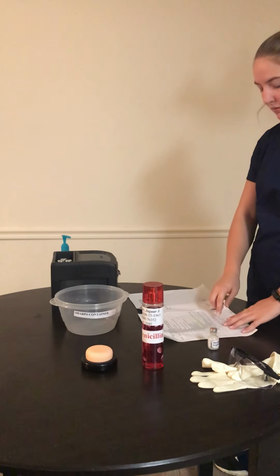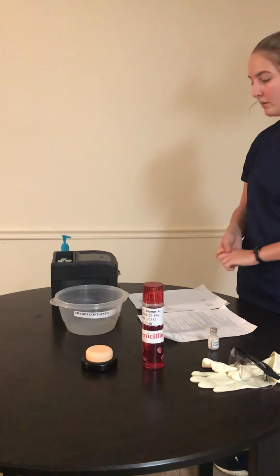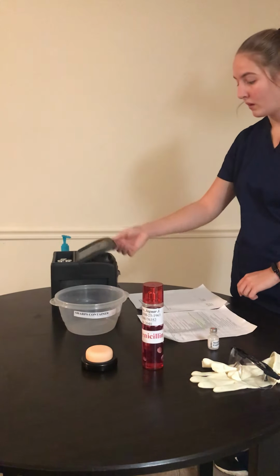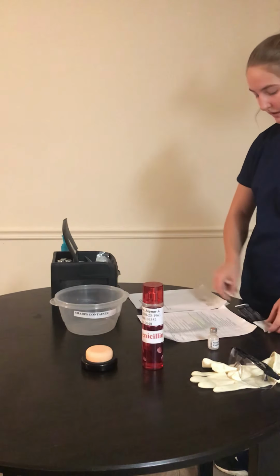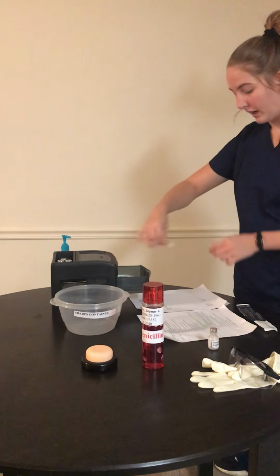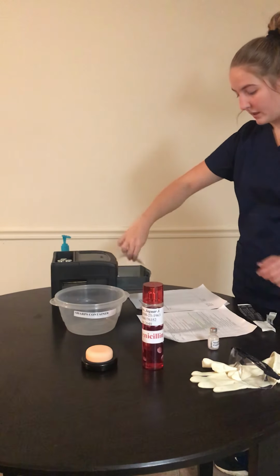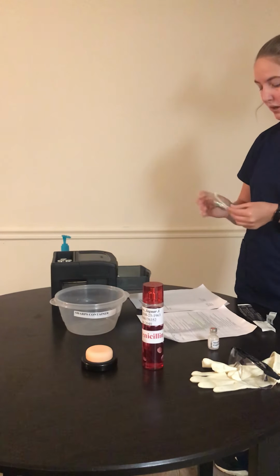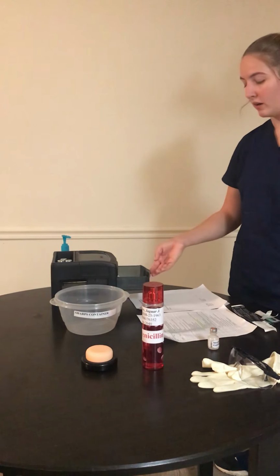The next right is right route. So we have IM intramuscular and IM intramuscular. For intramuscular, I'm going to need a 3 milliliter syringe, a 23 gauge needle, and a blunt tip cannula to withdraw the morphine sulfate needlelessly.